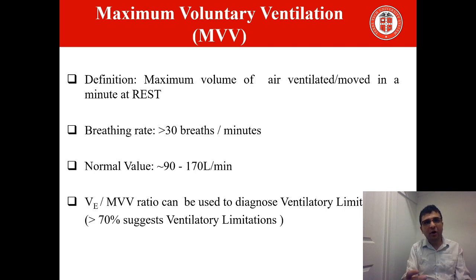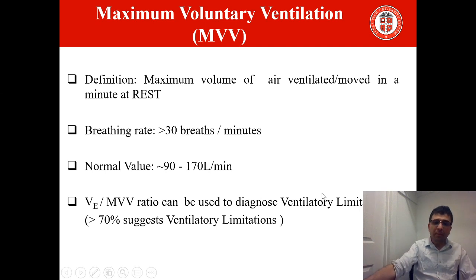So we'll start the clock and we try to breathe like this, as hard and as fast as I can, and measure the total volume of air. So the normal value is somewhere between 90 to 170 liters, somewhere in between.